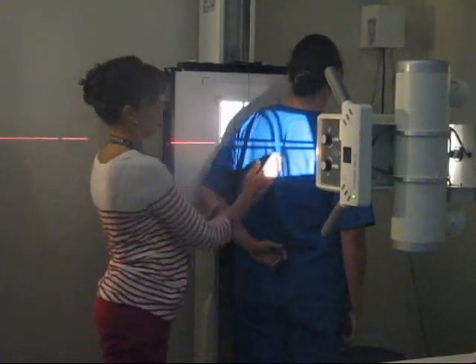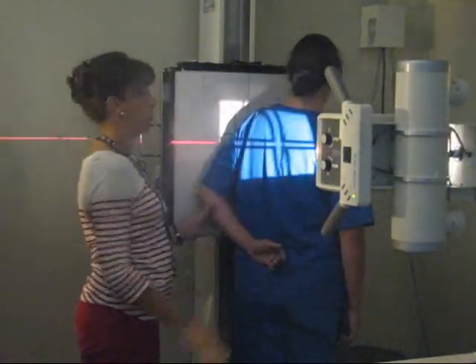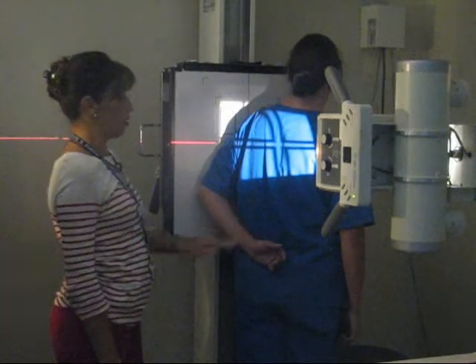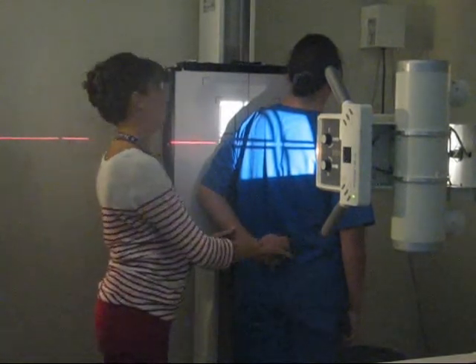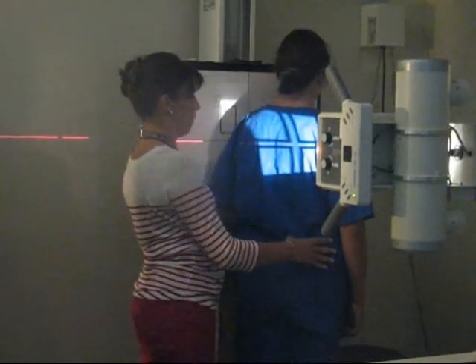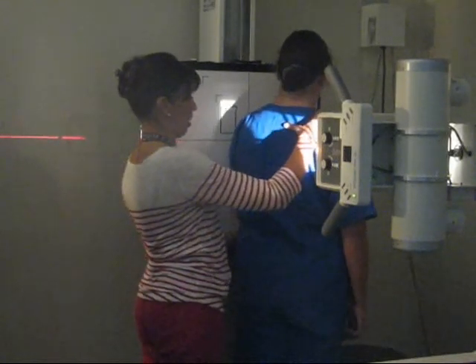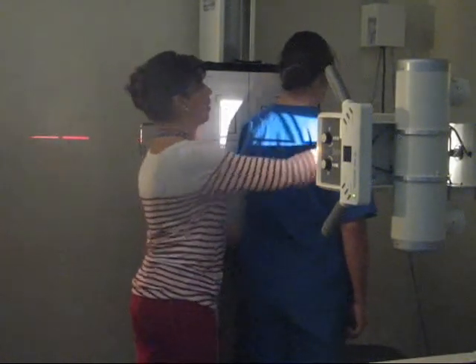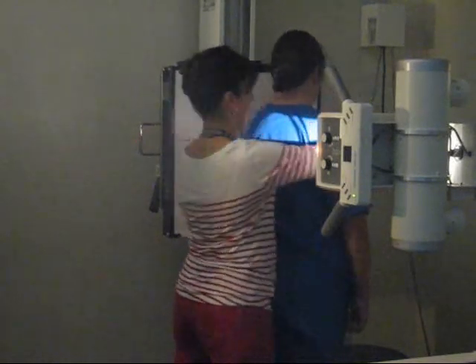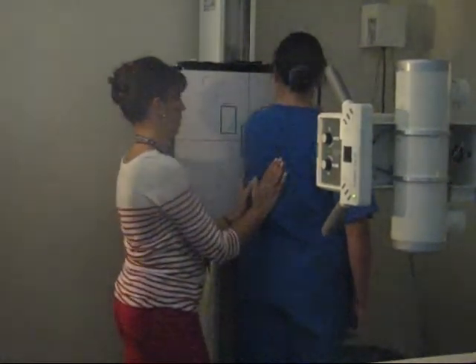Okay, and this is what you're going to get in your picture, a view of the lateral of the scapula. If for some reason your patient cannot bring their arm down, you can try having the patient bring their arm up in the front, kind of like bring their hand across their chest. Pause the video and review the procedure before continuing.